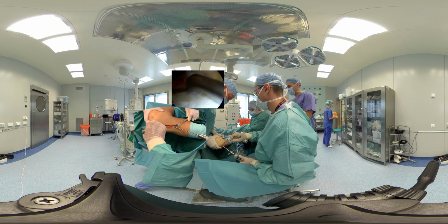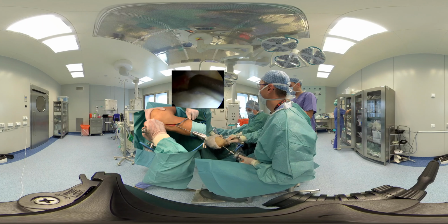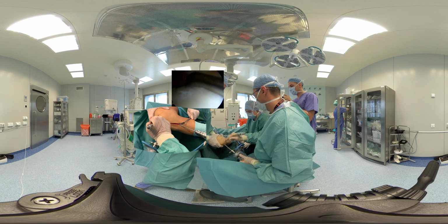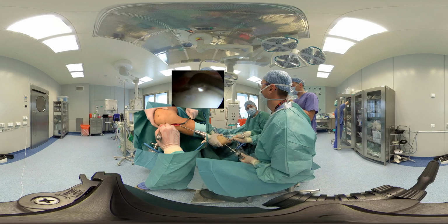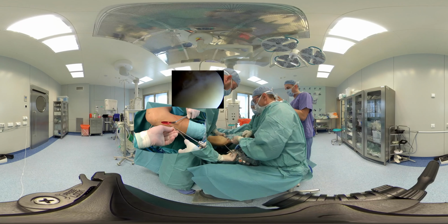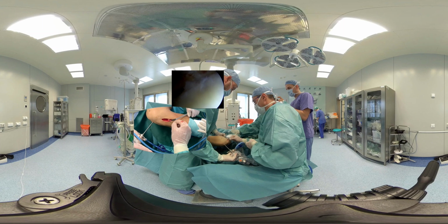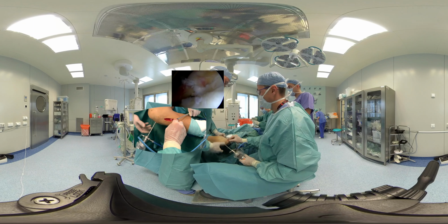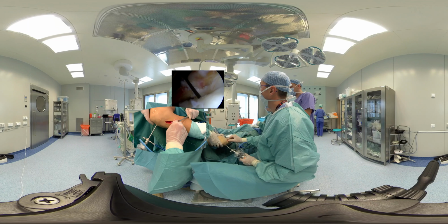We drill the tunnel with a 4.5 mm drill. Then we insert the guide monofilament into the tunnel. Then we use a manipulator to pull out the monofilament suture.